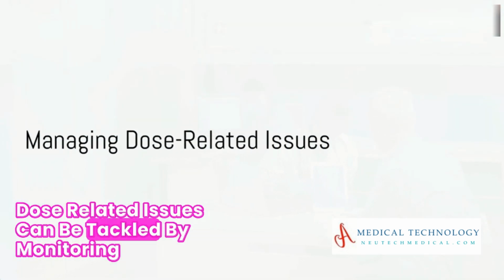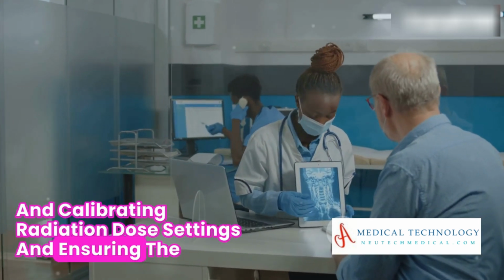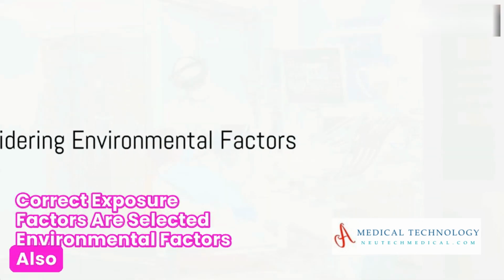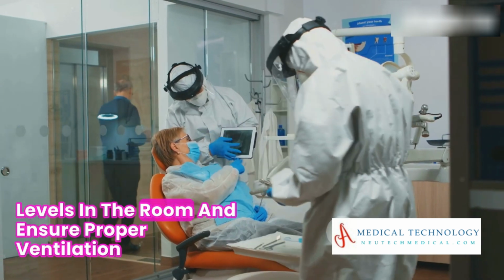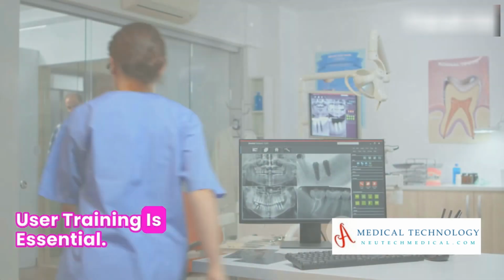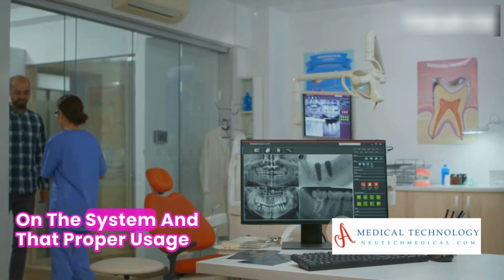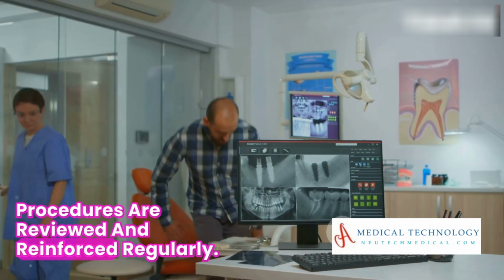Dose-related issues can be tackled by monitoring and calibrating radiation dose settings and ensuring the correct exposure factors are selected. Environmental factors also play a role. Check the temperature and humidity levels in the room and ensure proper ventilation for the system. Last but not least, user training is essential. Make sure that operators are adequately trained on the system and that proper usage procedures are reviewed and reinforced regularly.